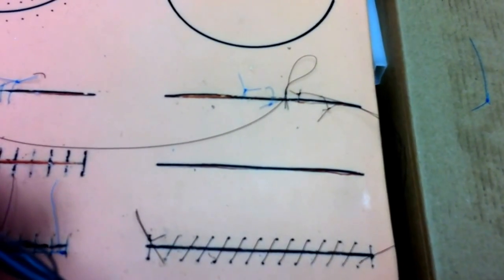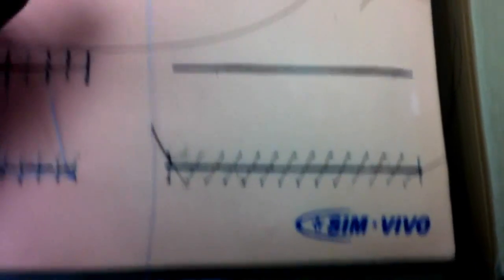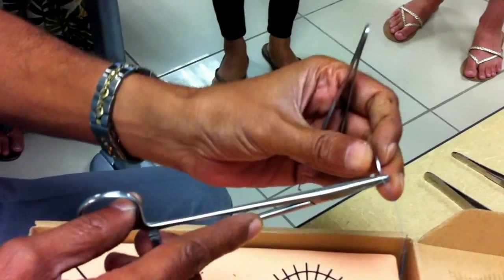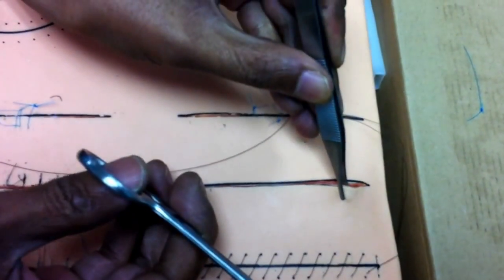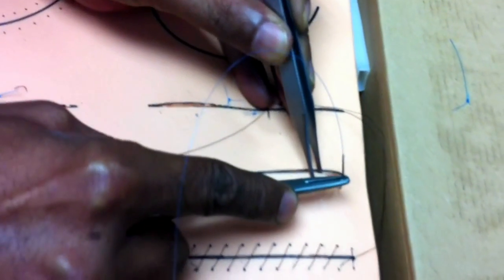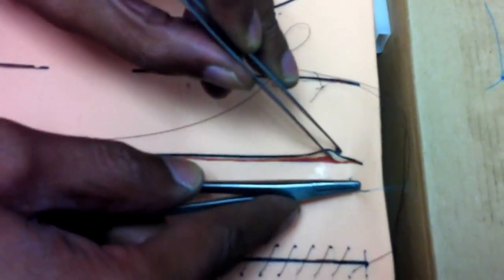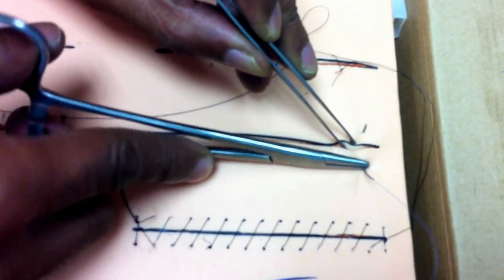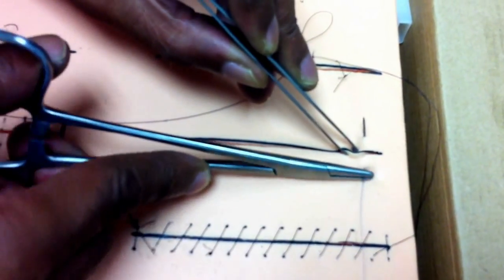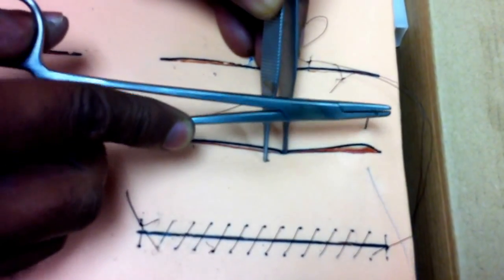So, as usual, this is the thumb forceps. We are holding it in our left hand, and I'm holding the needle holder in my right hand. I start by picking up one end. One bite. Pick up the other side, take the next bite. Make sure the tip comes out. Then you give it a little more push from the other side, and then you bring it out. Give a slight curving motion.